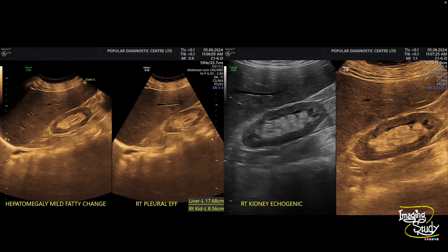The right kidney is slightly echogenic. Make sure you know the normal echogenicity of the kidney on your machine, because it varies from eyes to eyes and from machine to machine. I'm quite accustomed with my machine and I know this echogenicity is not the normal one — it is slightly increased. This patient also had mild right-sided pleural effusion, as you can see here.